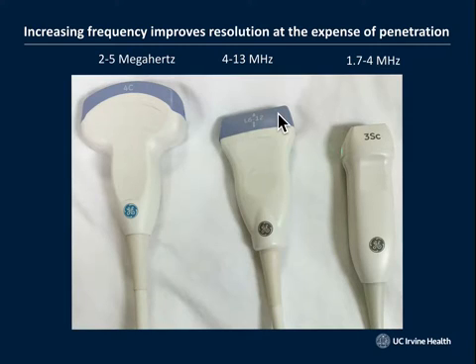The linear transducer is sort of the opposite of that one. It's got a very high frequency bandwidth, really nice resolution, but doesn't penetrate as far. And then you've got the curved transducer, sometimes called curvilinear, sometimes called abdominal probe. And it's a good trade-off between a good frequency bandwidth, having a lot of elements in it, makes very beautiful pictures of the abdomen.